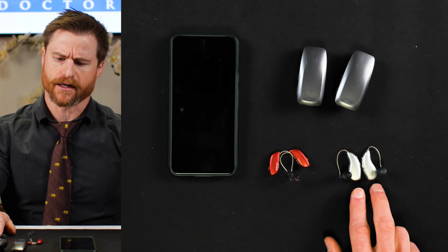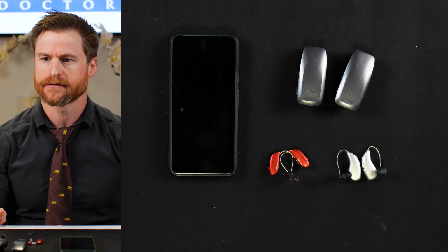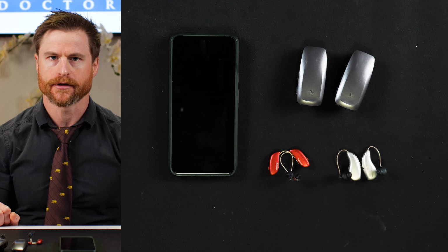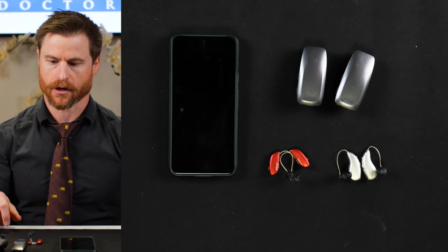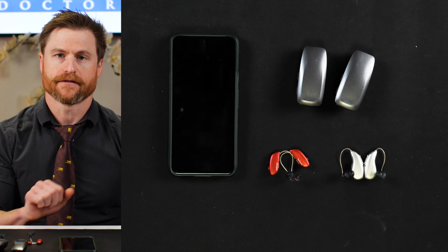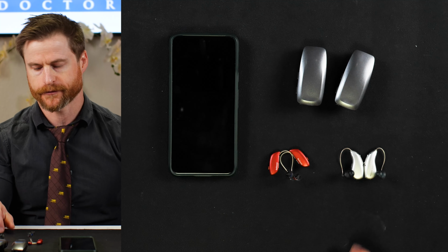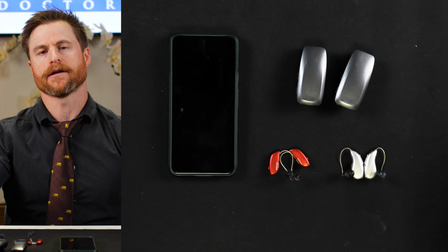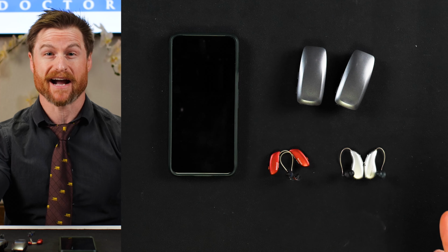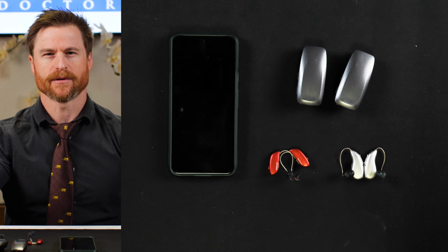Another thing you'd want to consider, if you are very sensitive to loud, sharp, sudden sounds, you're overwhelmed, you're physically uncomfortable in loud situations, you're going to be more comfortable in Phonak devices. It's just a smoother sound quality relative to ReSound. Okay, so the 3 good things about Phonak Infinio Sphere right now: streaming stability and sound quality with classic Bluetooth. Great. Speech processing in challenging listening situations when there's a lot of background noise. Great. And overall sound quality, smooth, a little bit more comfortable. Great.